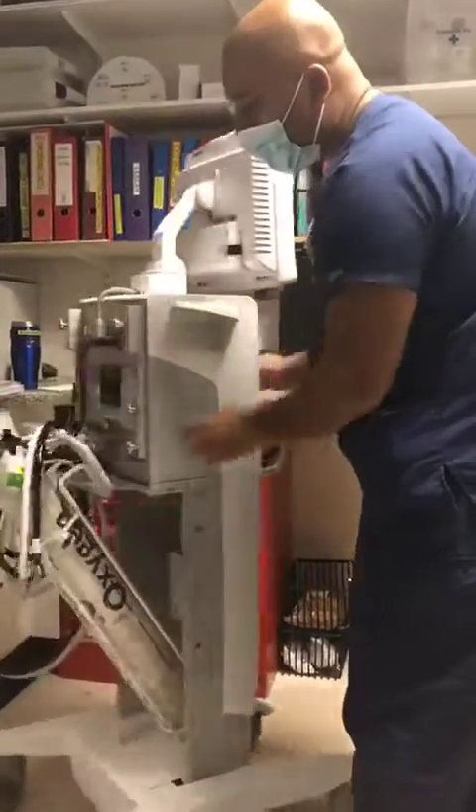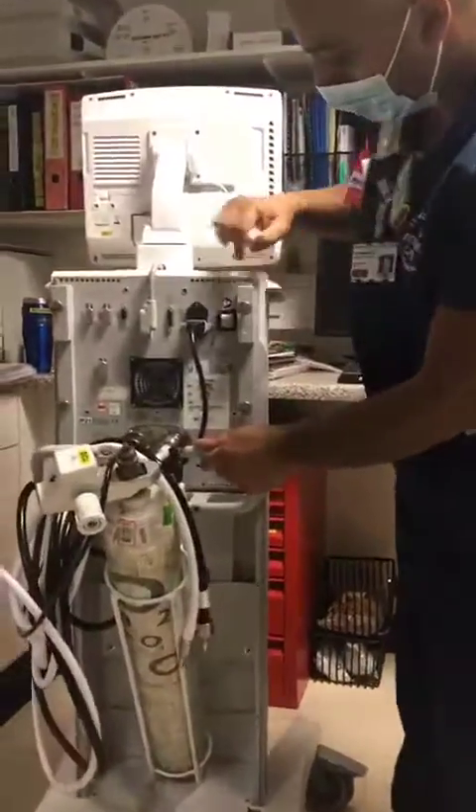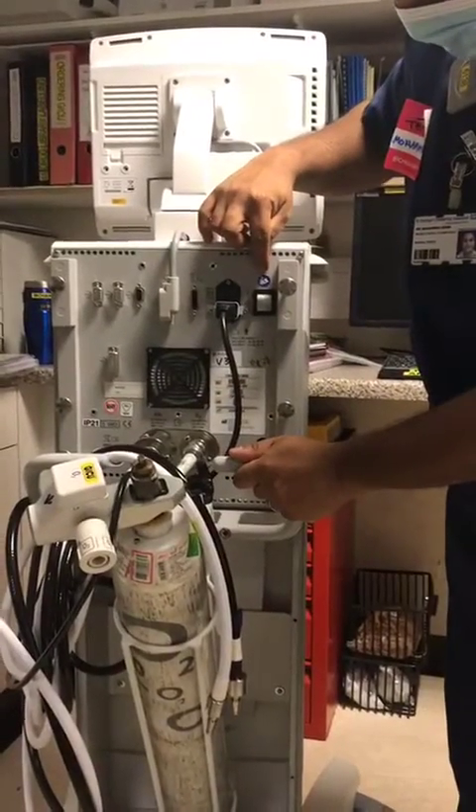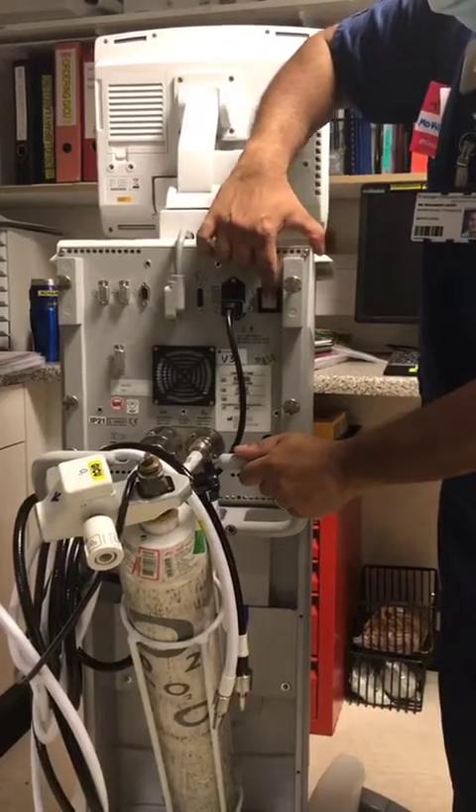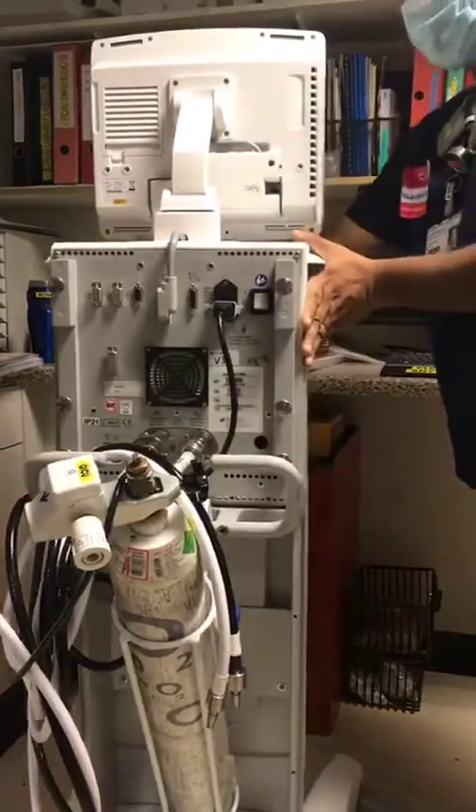To turn the ventilator on, the on switch is at the back over here. You've got a little blue man with a book — it's just hidden there. Just press it, turn it on, and the ventilator will turn on.